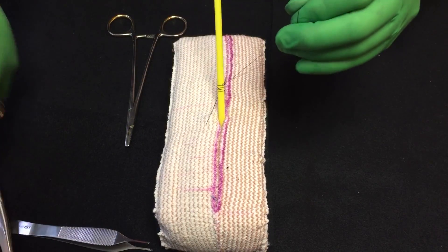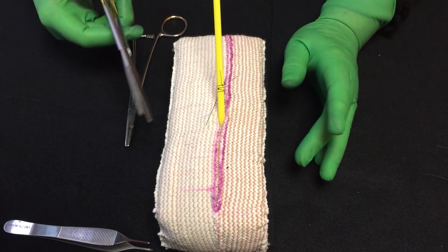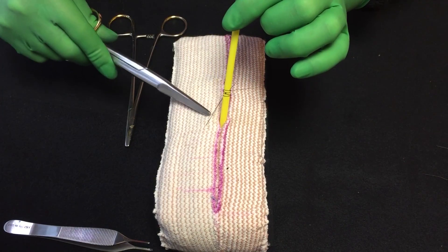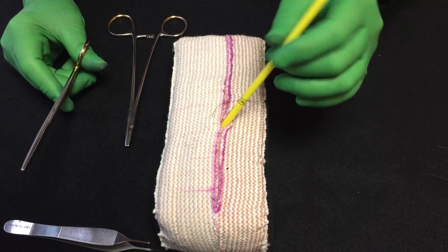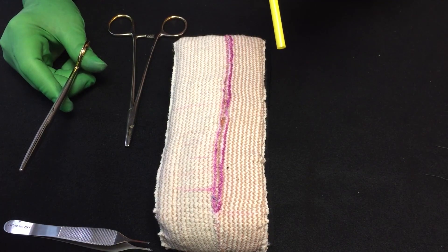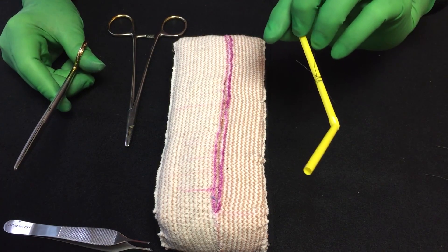Once you have that secured, then the patient goes home or does whatever they do. And then when they go into the office to get it removed, the doctor has a nice little loop right here that he can just slip through and cut it out and remove it easily. I noticed that the surgeon I worked with, once I started doing this, he started doing it with his drains too.